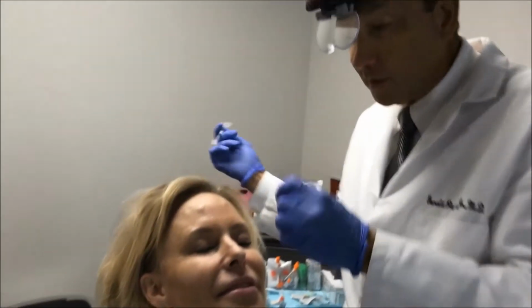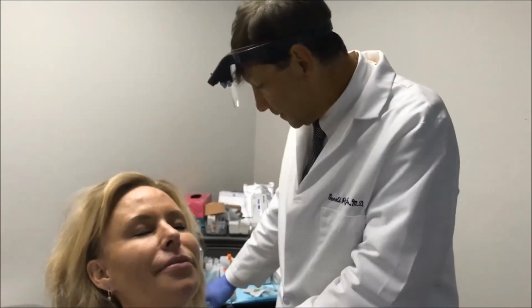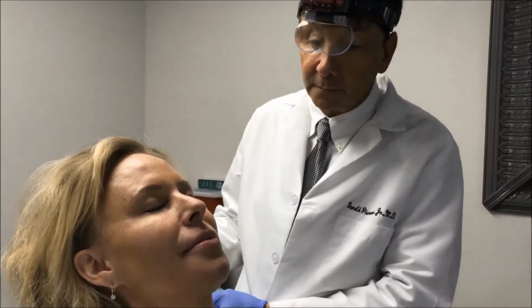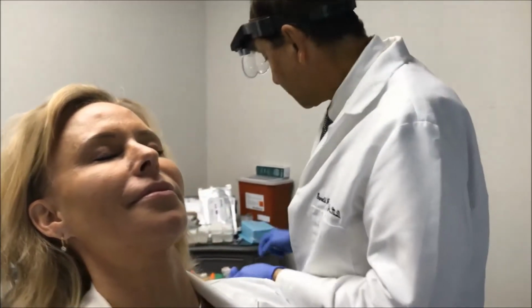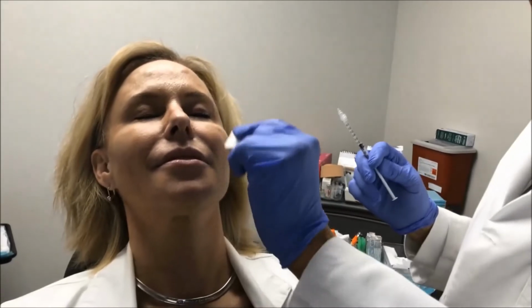What I'm doing now is just doing lidocaine with epinephrine to numb the sites where we're going to be doing the filler. We're going to be using Juvederm Ultra Plus in the lower face and Restylane Silk in the forehead. We're going to be using a micro cannula technique. We're also going to do a couple PDO threads for just a little bit of contour regularity right under an area of malar edema.